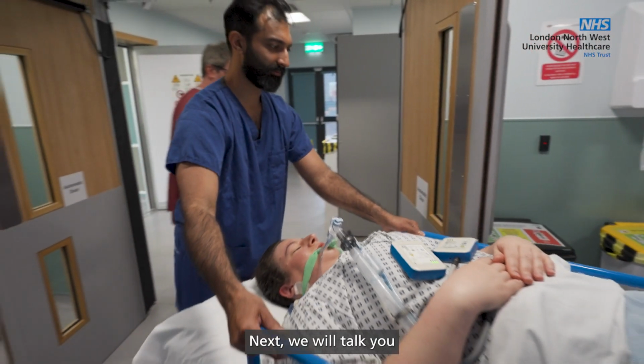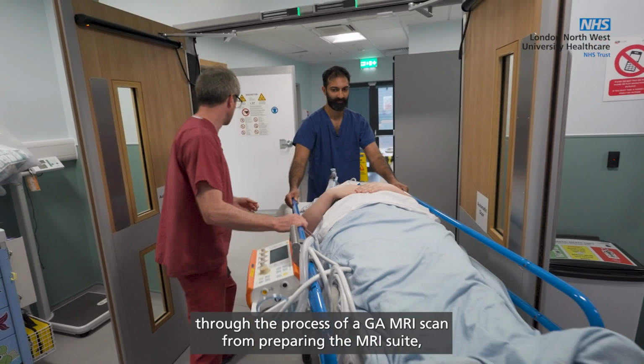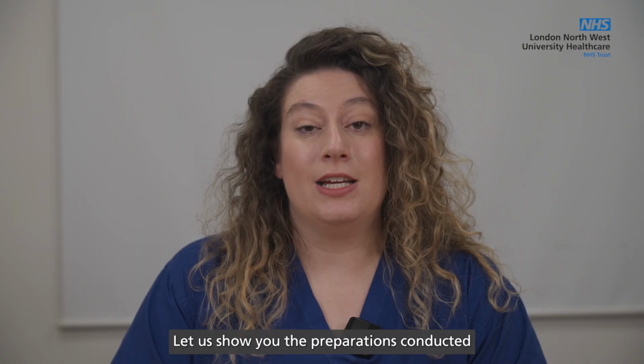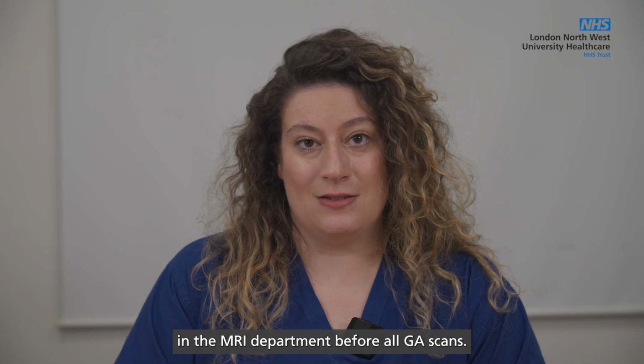Next, we will talk you through the process of a GA MRI scan, from preparing the MRI suite, the equipment you'll be using, preparing your patient, and the scan itself. Let us show you the preparations conducted in the MRI department before all GA scans.